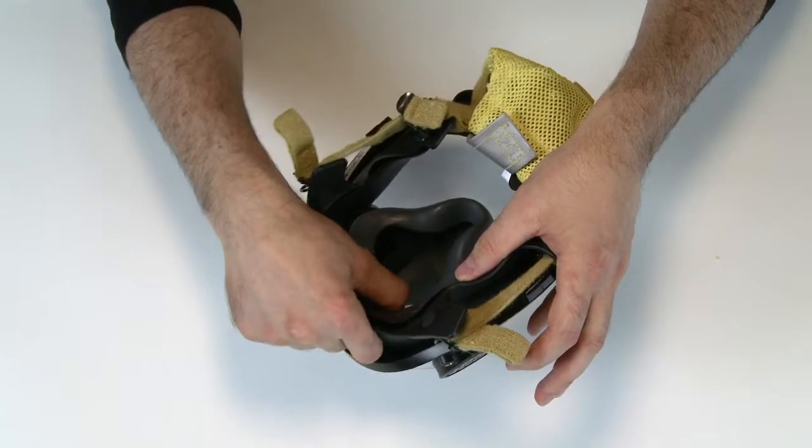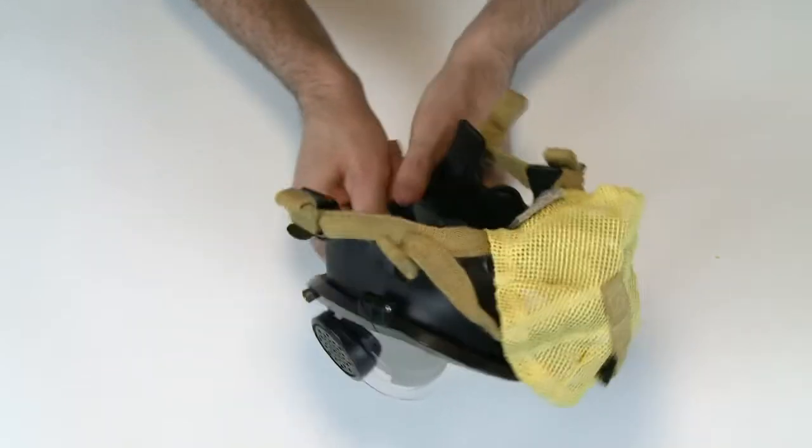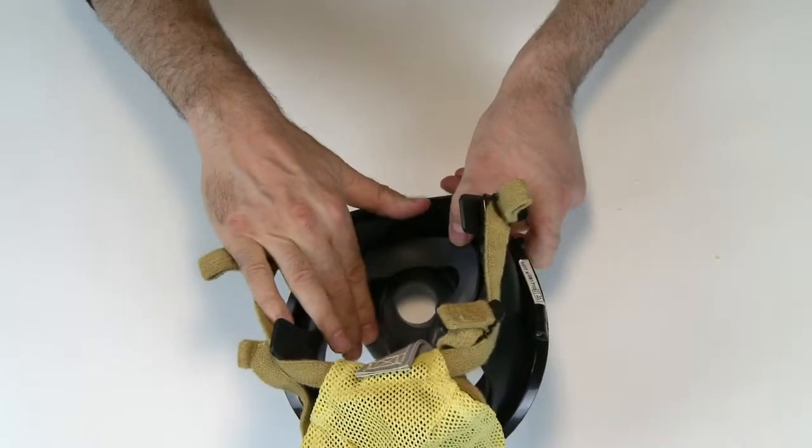Look carefully at the facepiece seal and other rubber components. Make sure there are no cracks or other signs of wear or damage, and that there are no deformities.